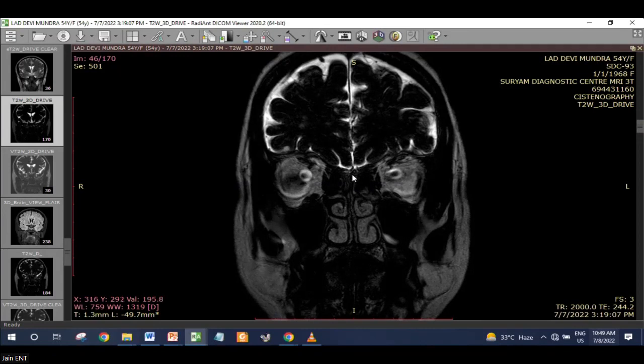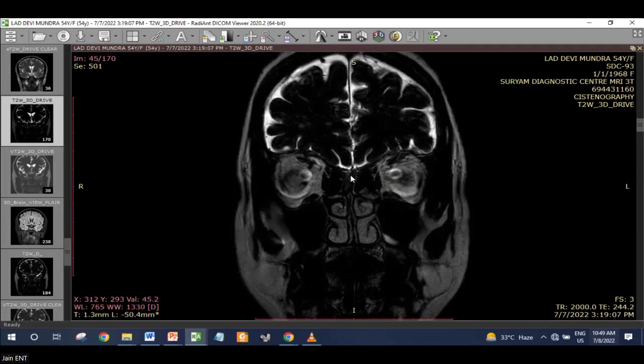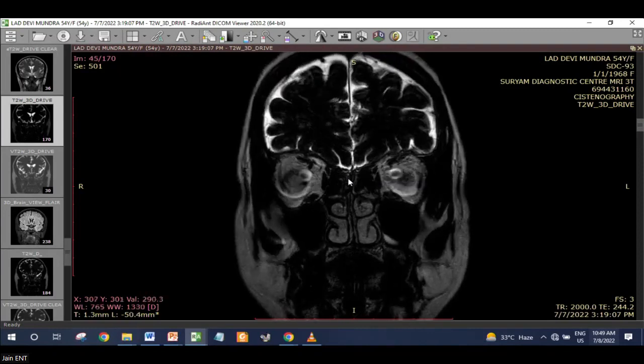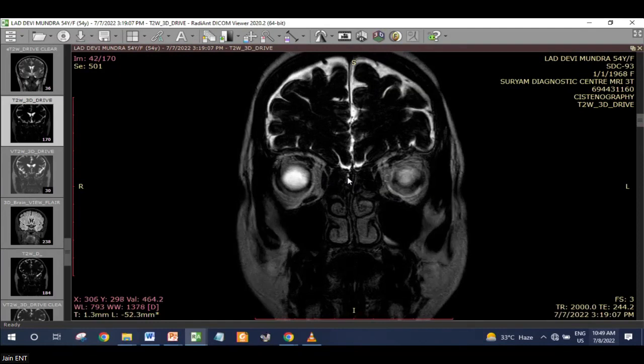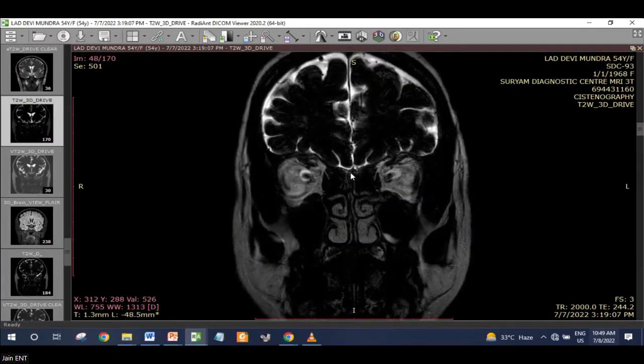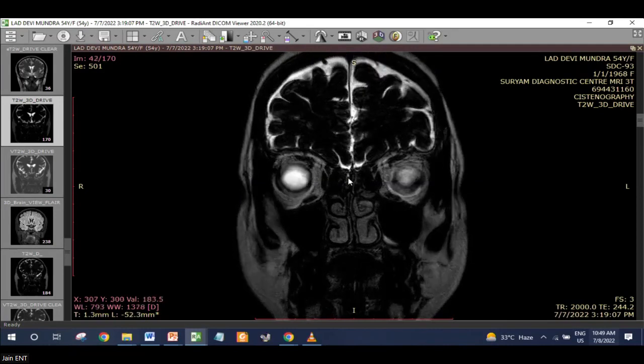There is, sir. That's why I told you to have dynamic imaging. See this. Dynamically, it is coming from there. That can only be picked up by dynamic imaging. You can see in continuity, this is coming from the CSF space. This one. That is why dynamic imaging is important. We don't advocate bringing the imaging on printouts. That is how you can pick it up easily.